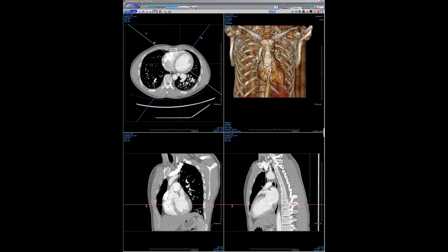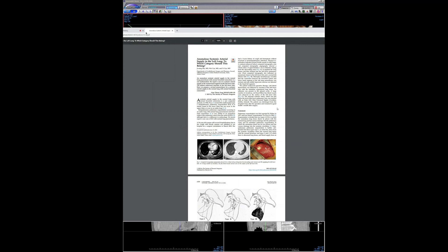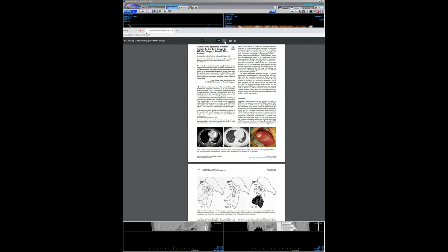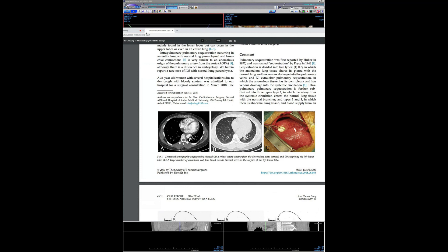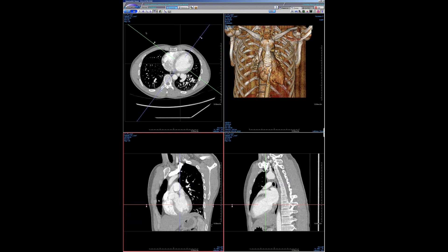You can see how hyperemic and engorged the vasculature is in the left lower lobe because it's being supplied by systemic supply. This is acting like a really bad left-to-left shunt. Probably at least 25% of his blood flow is going through this vessel right back to the left atrium into the left ventricle. He's a young guy, about 30, and his LV is quite dilated. After Googling it, this is known — it's called anomalous systemic arterial supply to the normal lung, most commonly at the bases. I had not heard of this entity before.